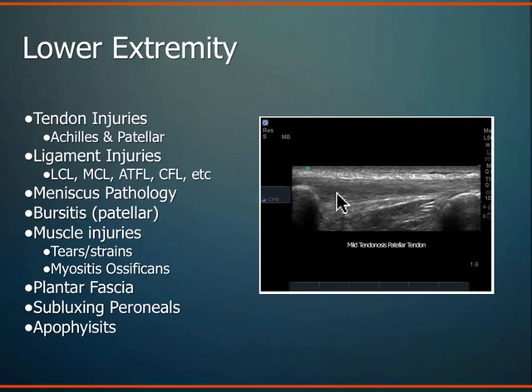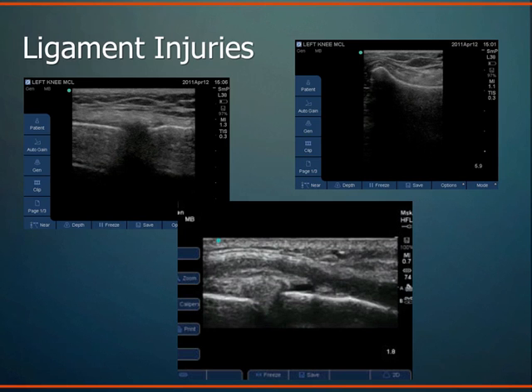And then around the ankle, you can visualize those peroneal groups, ATFL, anterior talofibular ligament, all the common ligamentous structures that you see in your common ankle sprains. All these bursal sacs tend to be very superficial. You can image those quite well. And again, those muscle tears, muscle strains, full ruptures, hamstring, very, very common injury in sports, hamstring tears. You can see that quite well on ultrasound.